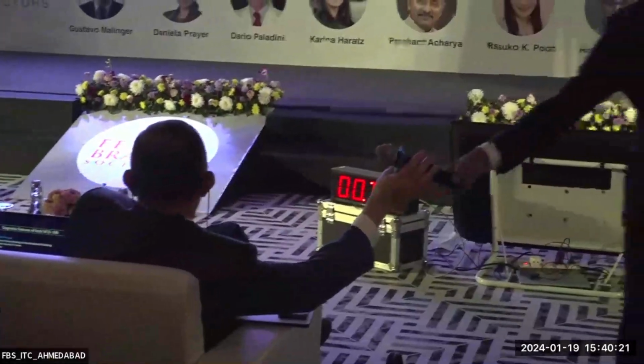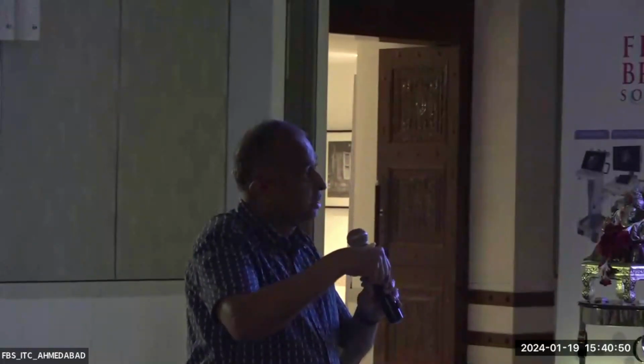The other point is that when a deep medullary vein comes from the surface and penetrates inside, together with it, it drags a sleeve of pia mater. And pia is very reflective. That is why you see them as brilliant specular reflectors in those areas. The pia mater is reflective. So I think it's not only the venous walls, but also the pia mater, which comes in as a sleeve around the vein.